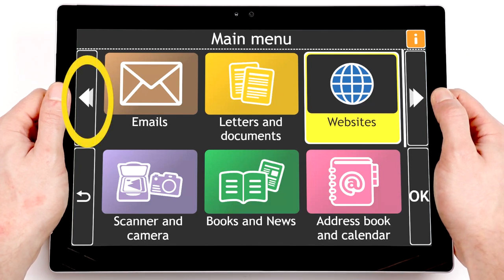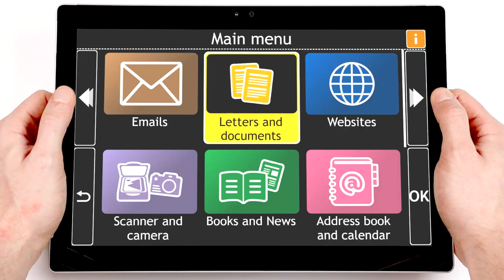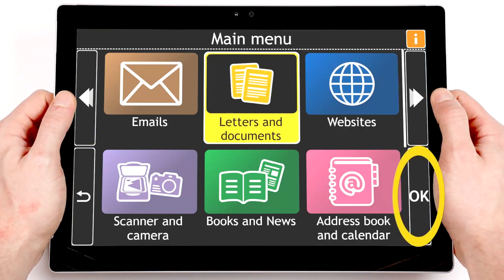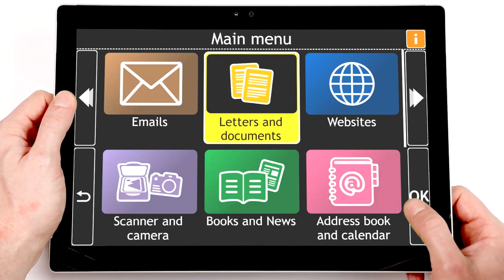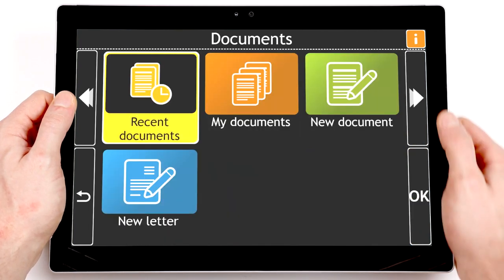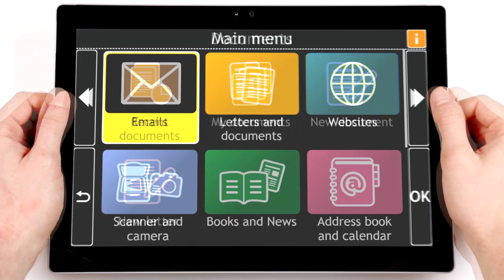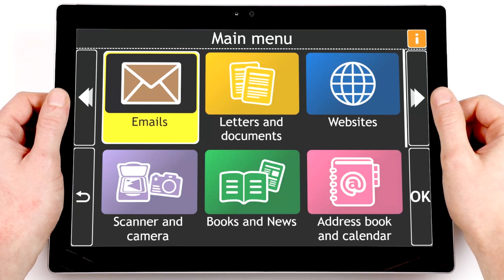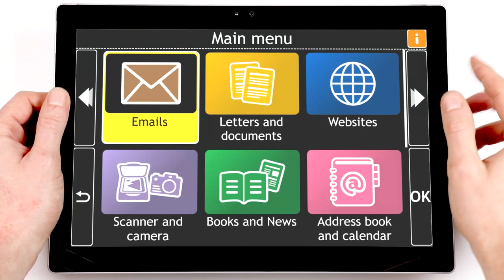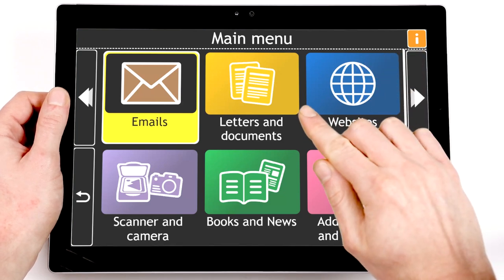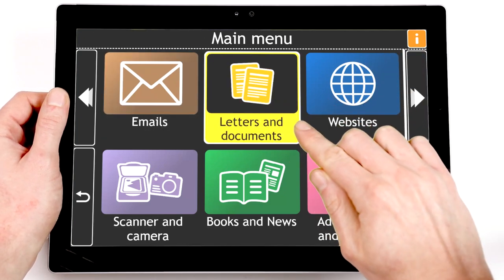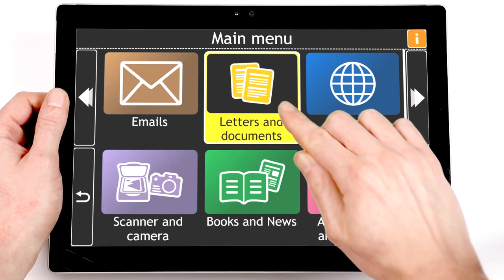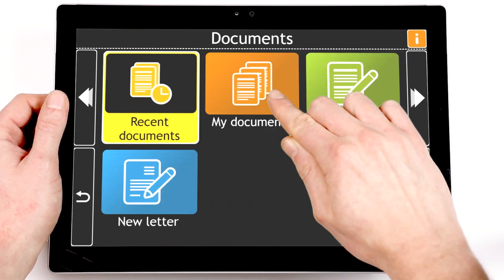The Previous button on the left edge moves you to the previous item. The OK button at the bottom right edge selects the item and opens a new screen. You can select any item on this screen by tapping directly on the item. Tap once to have the item read out loud — Letters and Documents, 2 of 10 — and tap twice to open the item.